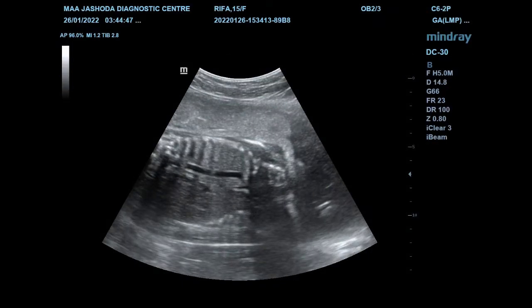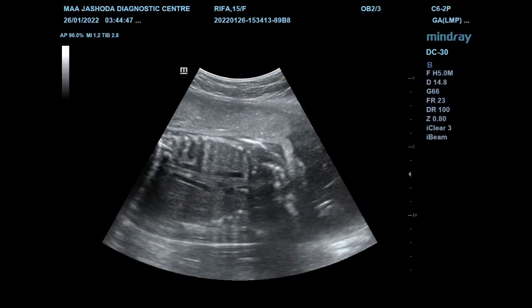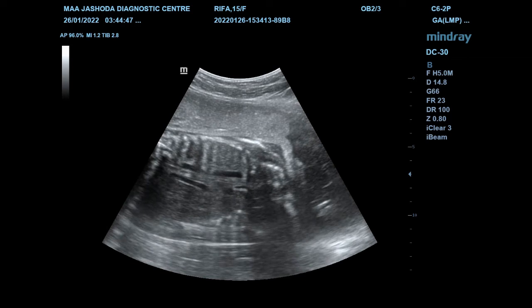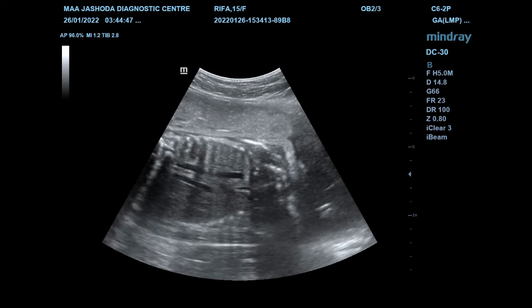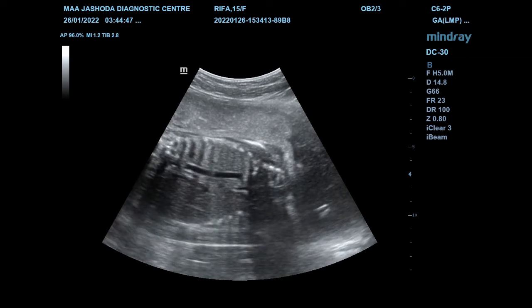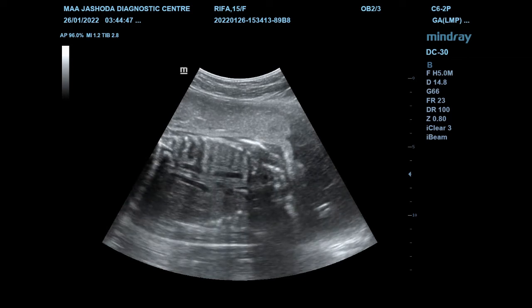This is the longitudinal plane. The aorta is seen in the upper part and the IVC is seen in the lower part.